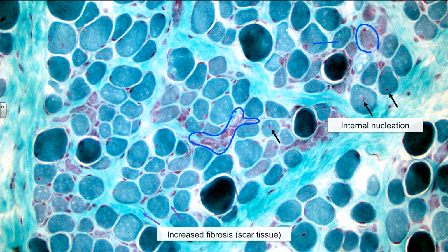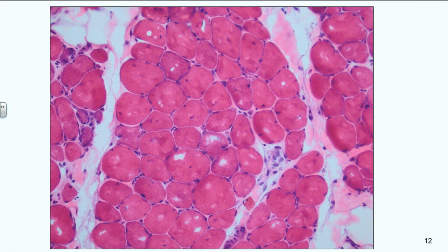We're not expecting any in Duchenne muscular dystrophy. For instance, if the sarcomeres were falling apart, that would be a different thing. If there were vacuoles in the myofibers in another set of disease, the Gomori would have a different look to it. But here we see very nicely that the cytoplasm is not so bad, except for the fibers that are hyalinized, of course.